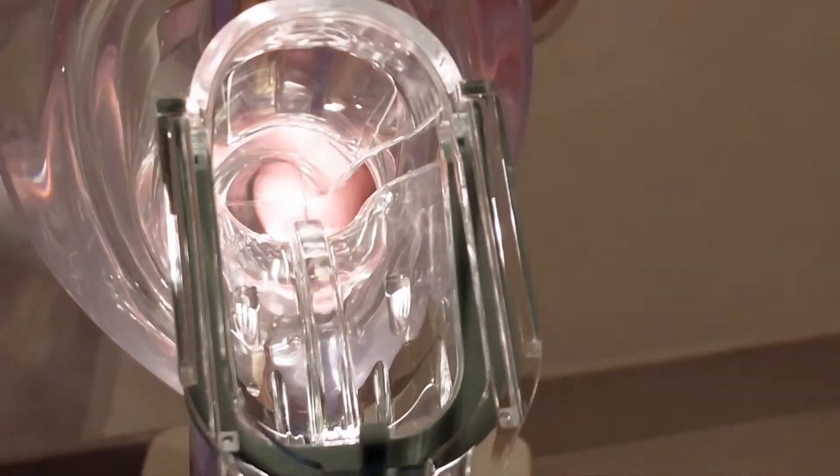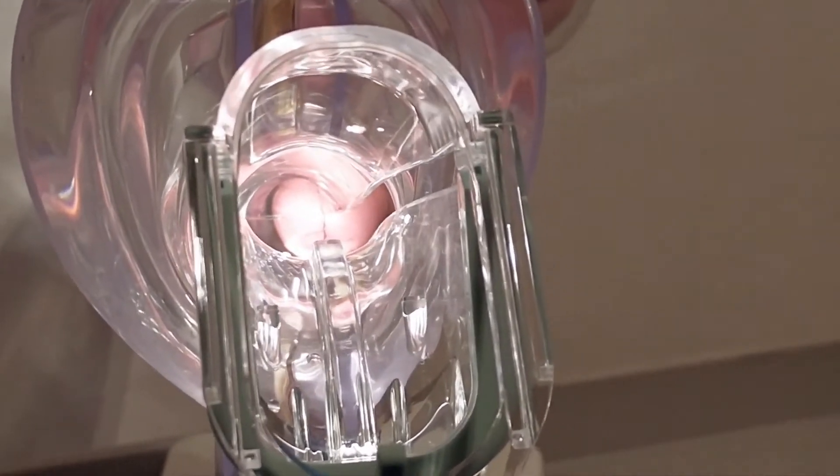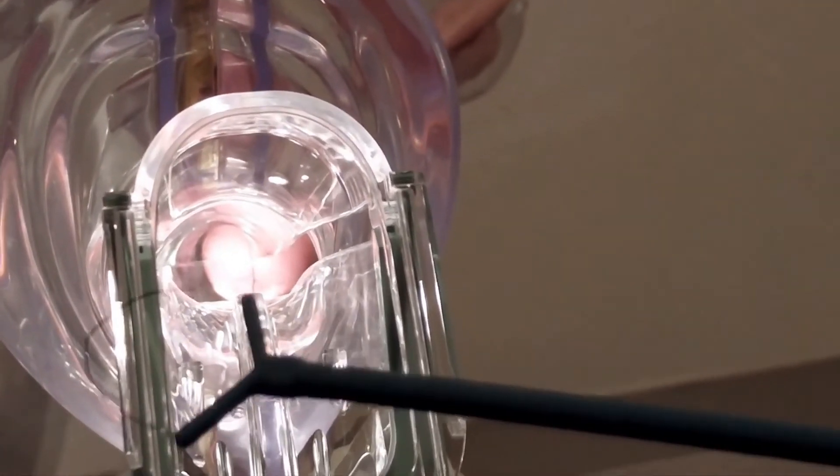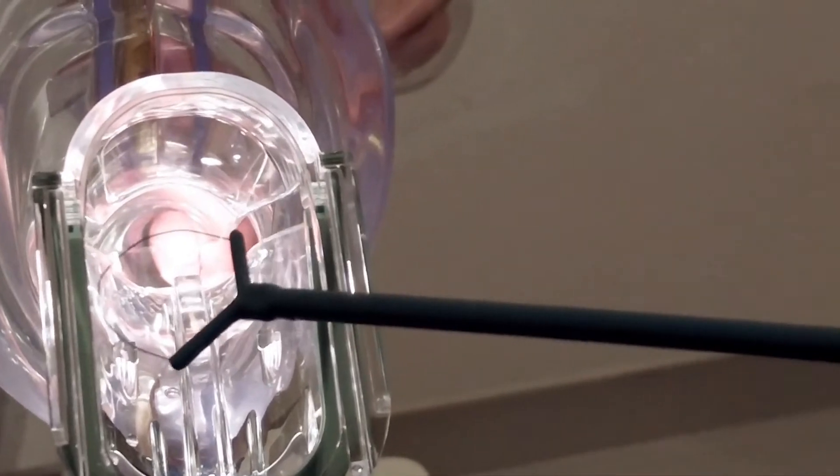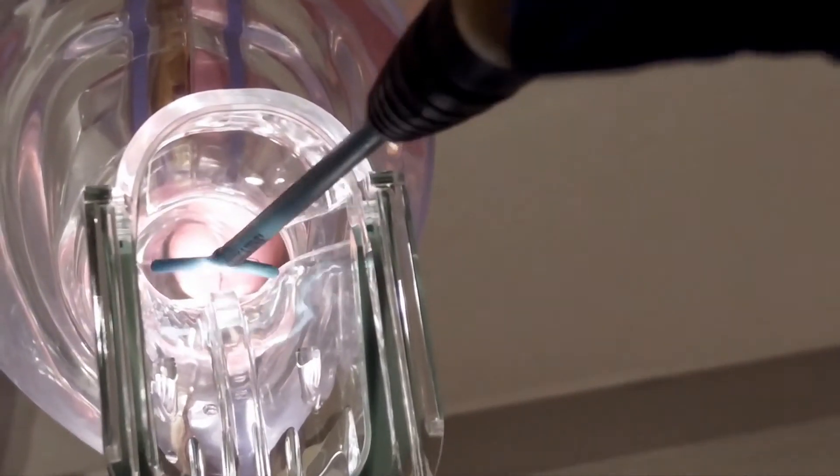It's four little injections that will numb the area and then we use a little loop just like that that is attached to a device called diathermy and that loop goes in and removes abnormal cells.